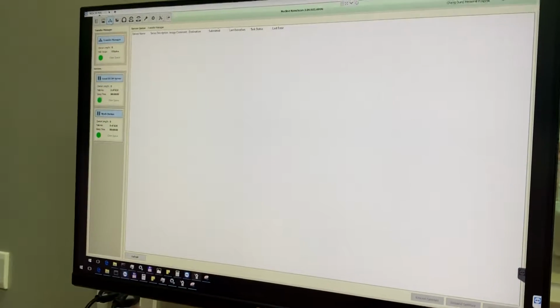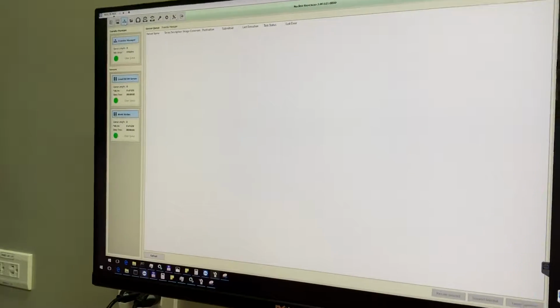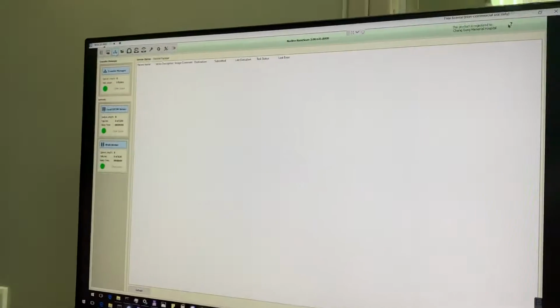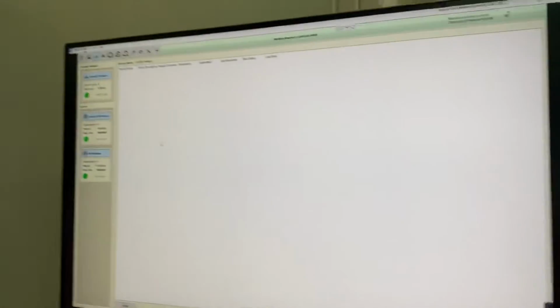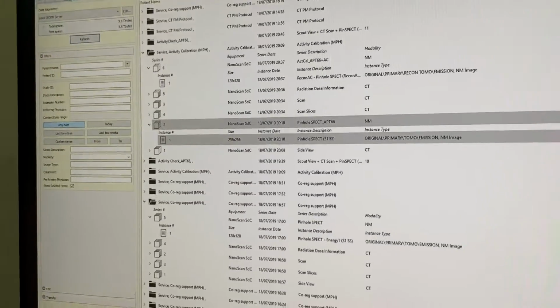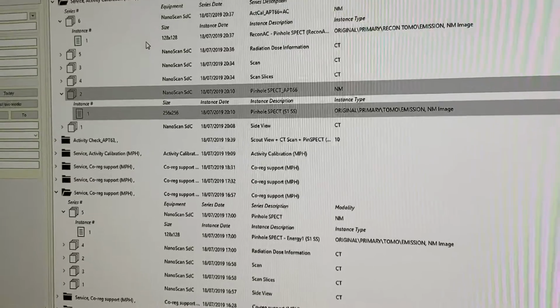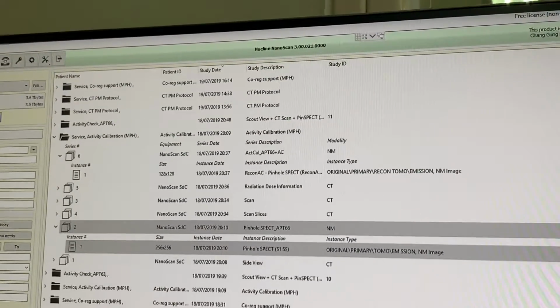maybe you can also set up some target repository in order to save scans as a backup or something, so it will also be indicated here, but usually you don't need to do anything here. What you need to use is the study browser. Okay, so this is the fourth tab.